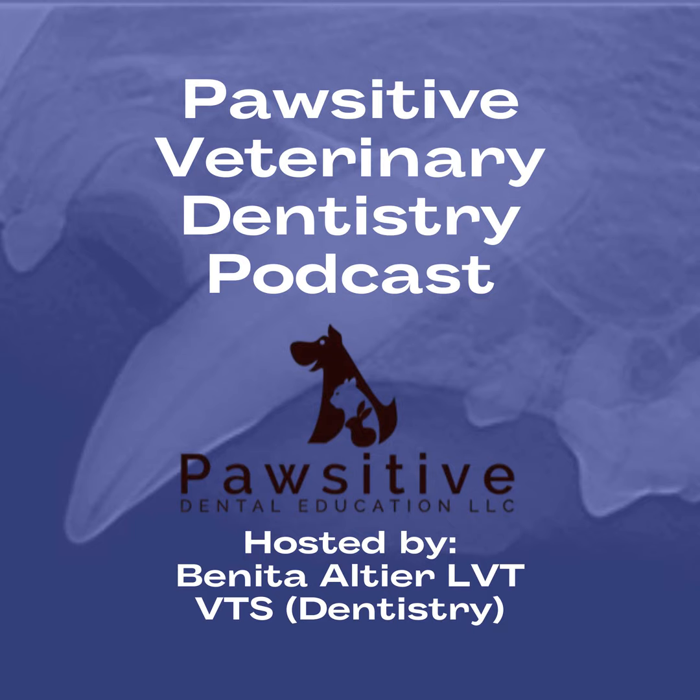Yeah, I think that's wise to think about it as a strategy for getting better at your own interpretation game. If you could bounce these radiographs off an expert, a veterinary dentistry expert, I would say, not just a radiologist, somebody that really understands the oral anatomy and pathology that we're looking at, they're going to give you feedback and either confirm or deny what you think you are seeing, so that you can get better at doing your own interpretation as you need to in your practice while the patients are under anesthesia. Because sometimes, again, it's not as easy to have that stat resource potentially.